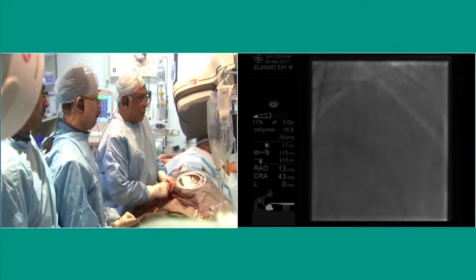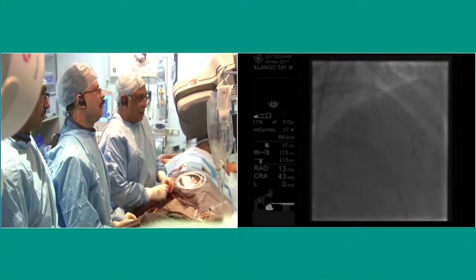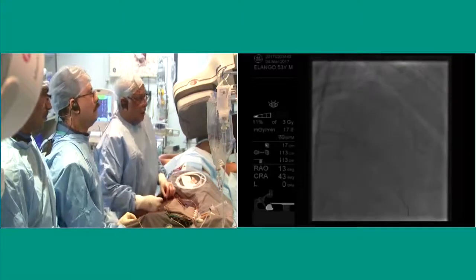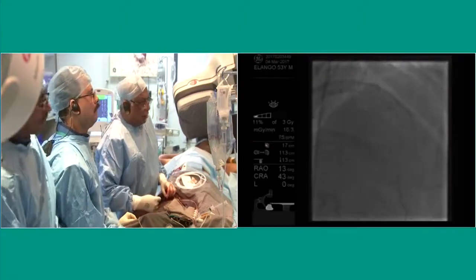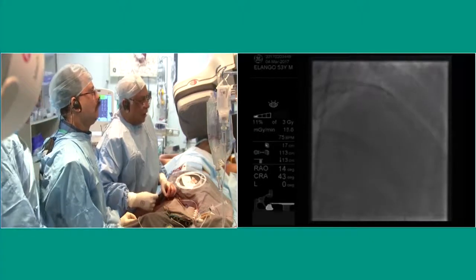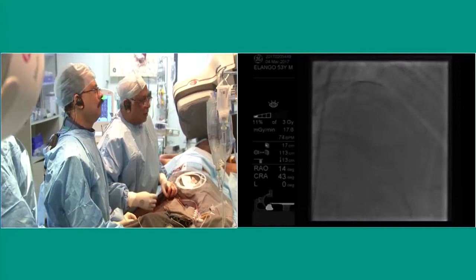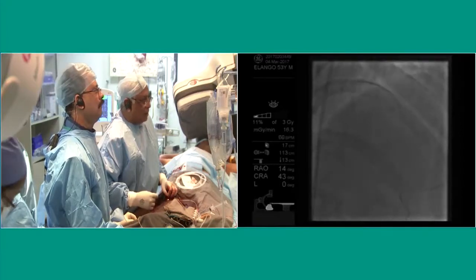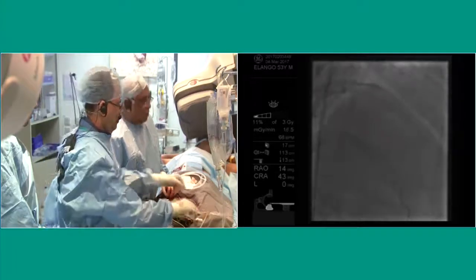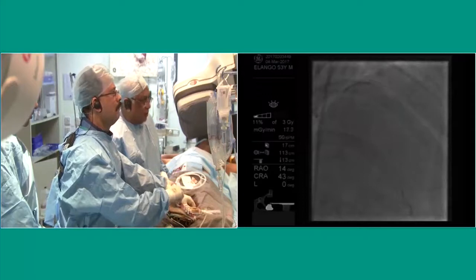Is that the proximal lesion which has difficulties? The proximal lesion hasn't been dilated. Now I will listen to your second suggestion. The wire is coming out. I purposely did it to remove the wire bias if it was there, and from the diagonal. And then I will bring this. So, Mathew, from the diagonal.